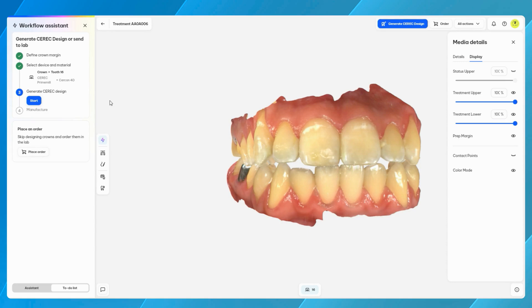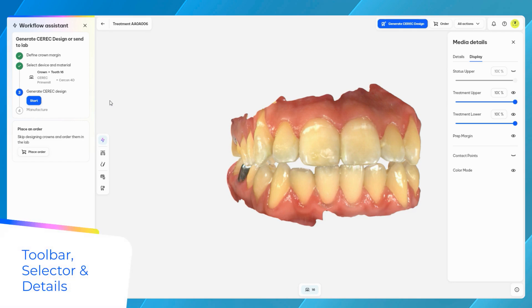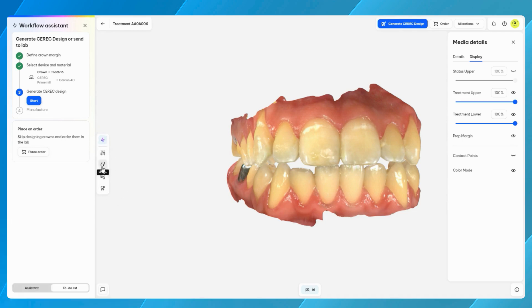Finally, the UX is responsive and therefore fits in multiple screen sizes. Attached to the Workflow Assistant is the toolbar, which grows while advancing along the workflow steps.